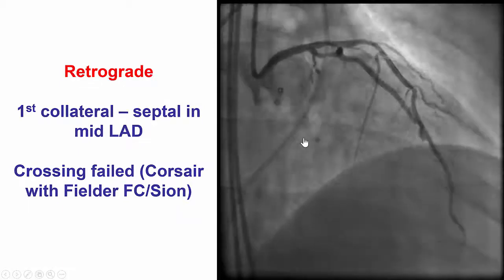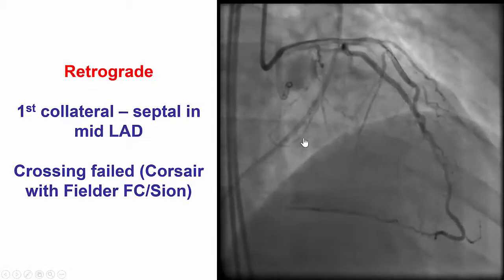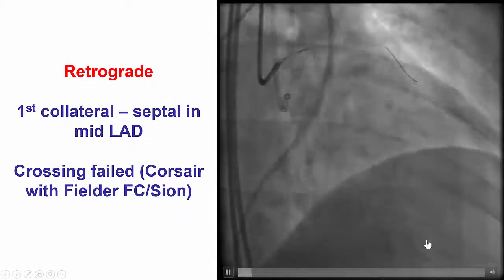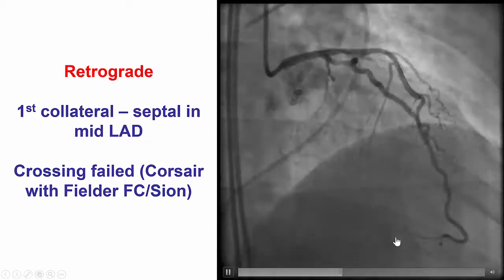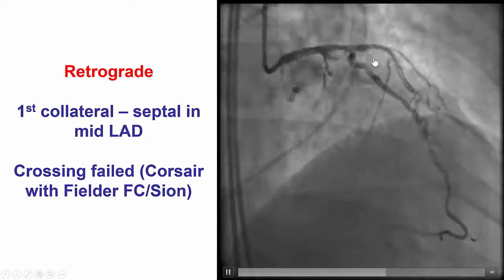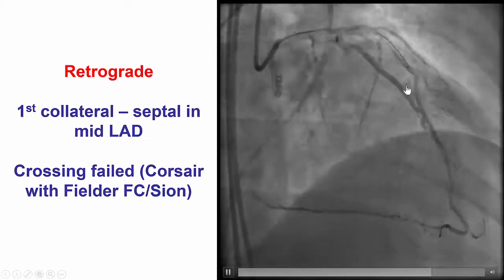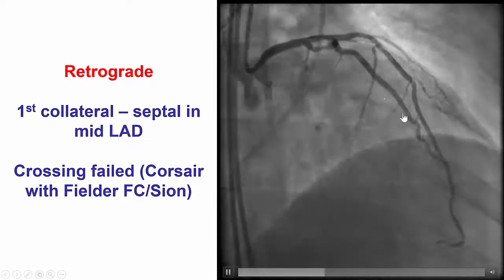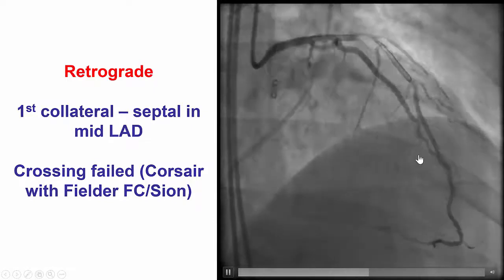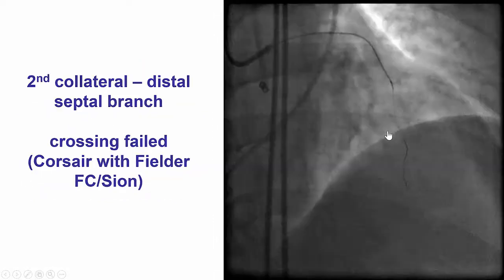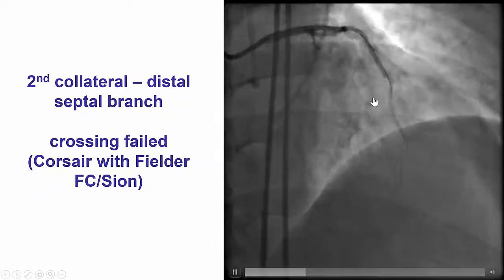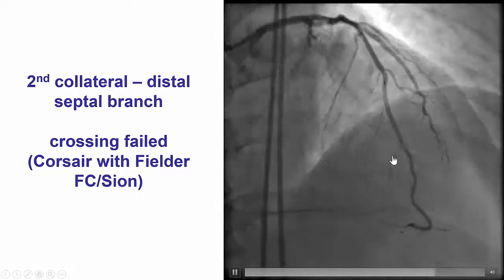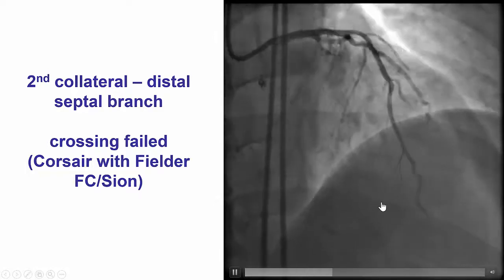We therefore switched to a retrograde approach. Although the biggest collateral was the epicardial from the distal LAD, crossing through septals is safer. So before going there, we first tried surfing of several of the septal branches. However, surfing was unsuccessful in both the more proximal as well as the middle and more distal septal branches.